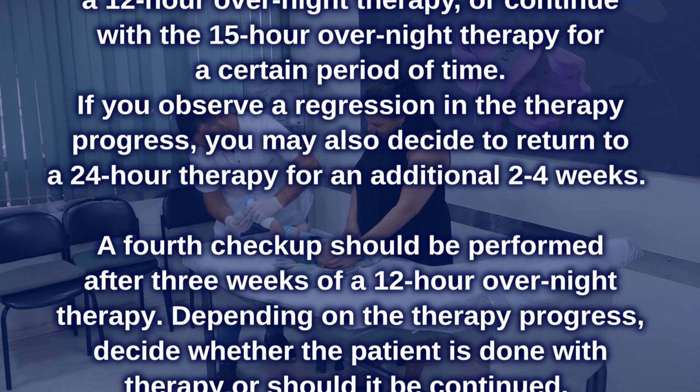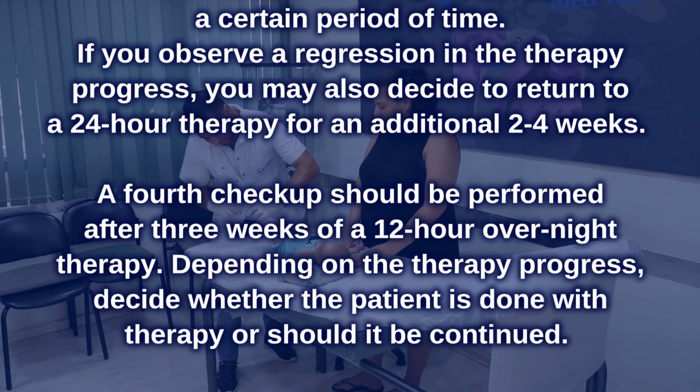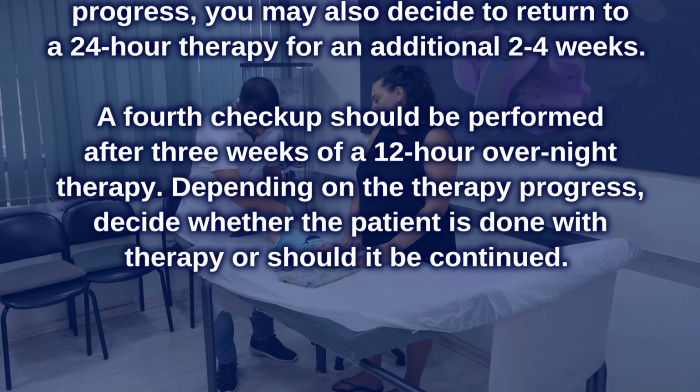A fourth checkup should be performed after 3 weeks of a 12-hour overnight therapy. Depending on the therapy progress, decide whether the patient is done with therapy or it should be continued.